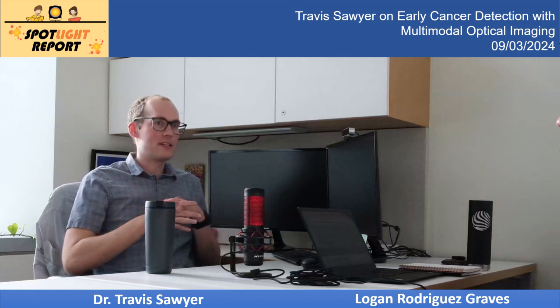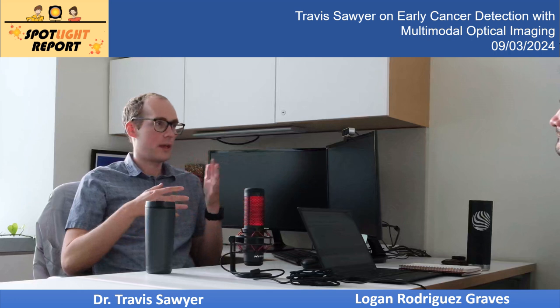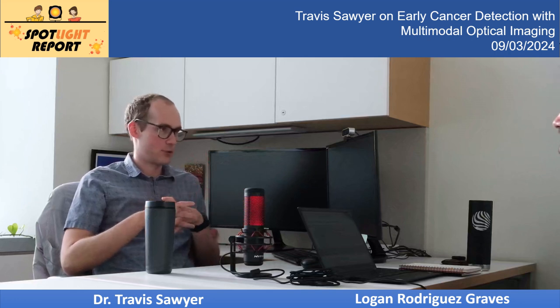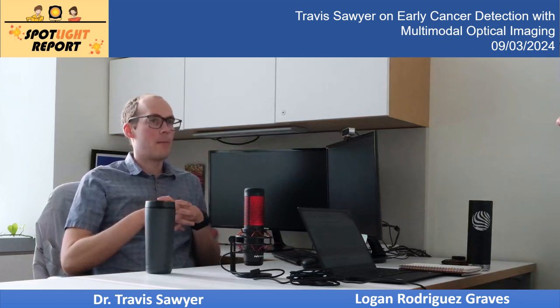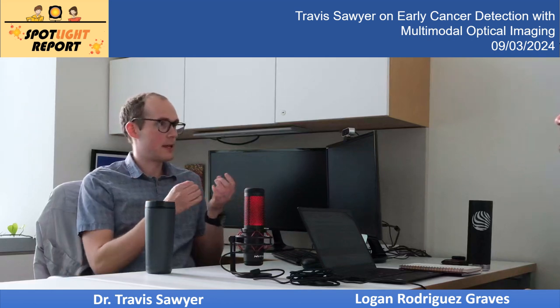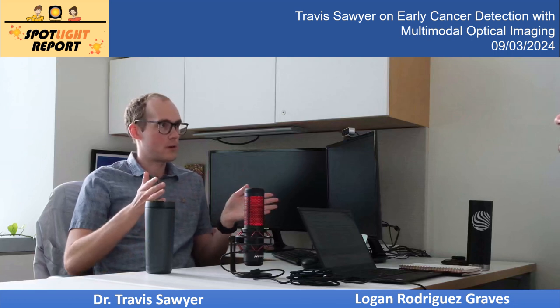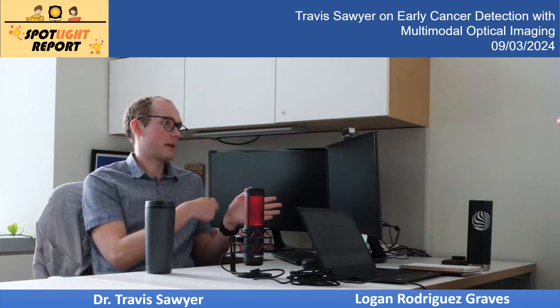Yeah, sure. So I think OCT is an awesome technology, and it is used clinically in some fields now. So ophthalmology, they have OCT devices to measure the retina and its thickness. I think I alluded to it earlier, but essentially OCT, as you said, is an interferometer, and it's just trying to interfere the reference arm with whatever light comes back from your sample.